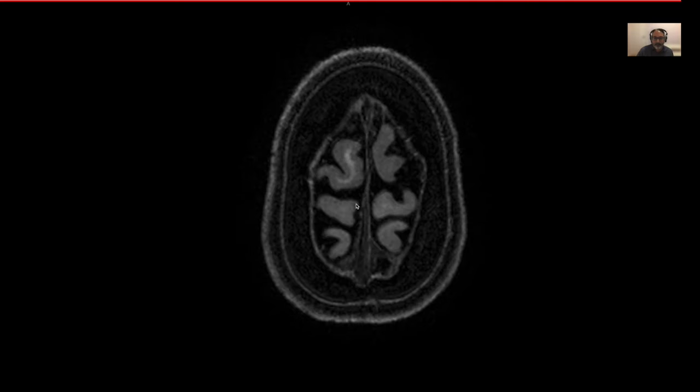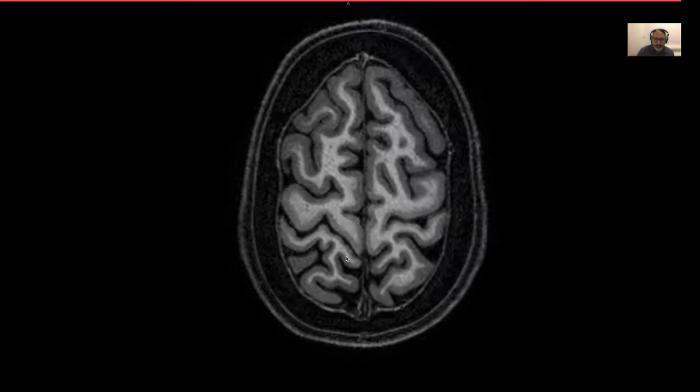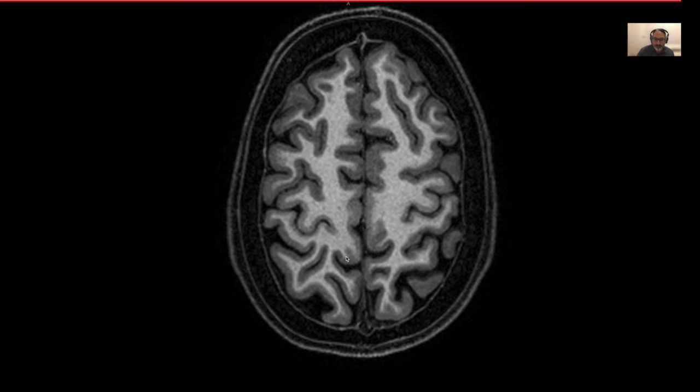The next thing you have to do is be able to tell which lobes are which. So you have to find out which one's the frontal lobe and which one's the parietal. The occipital comes a bit later. For frontal and parietal lobe, they use this thing called the inverse omega sign. And omega is, you see that? That's the omega. And that's the omega on that side, but it's the inverse omega sign. That means it's an upside down omega. And if you see that, that is the central sulcus. That is one.